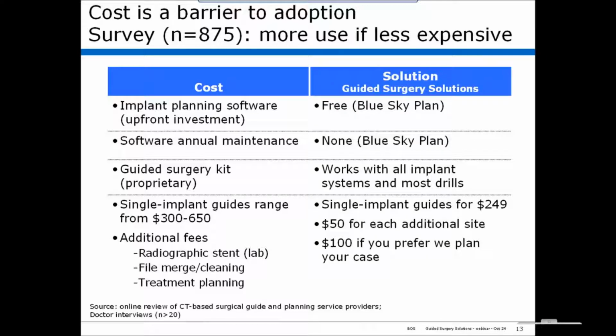It depends upon whether the doctor has a scanner in his office or not. It would be a different protocol. I can cover both. Okay. If a doc has a scanner in his office, then we recommend the following protocol, which is a wonderful protocol because it eliminates scatter as a variable in terms of the merges.